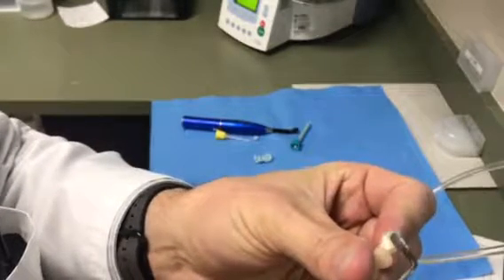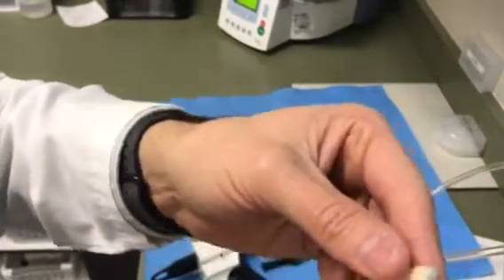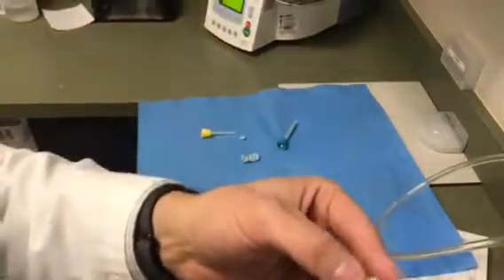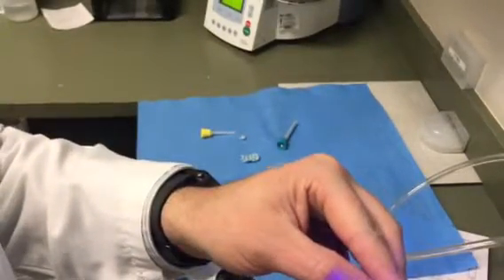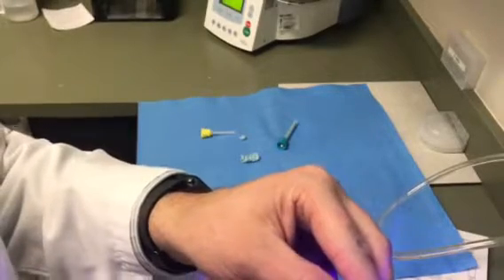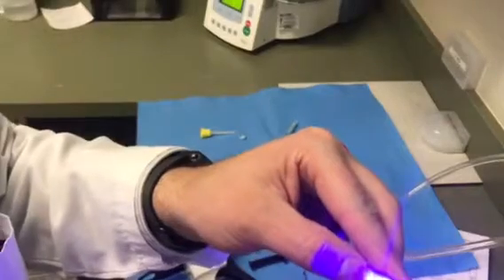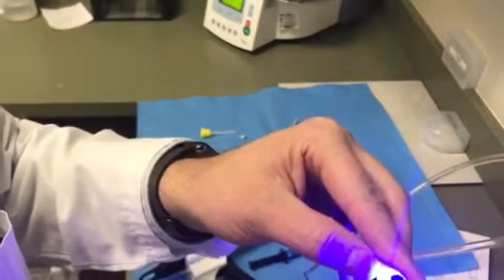So it takes me just a little bit longer because I've got to actually take the time to shape it, and I shape it and cure it, and then I try it in the mouth and out of the mouth and in the mouth and out of the mouth until I get it adjusted. And I'll take my handpiece to it and smooth it out a little bit. But basically, it's almost like I'm trying to add it to get it to where it's 90% the way there.